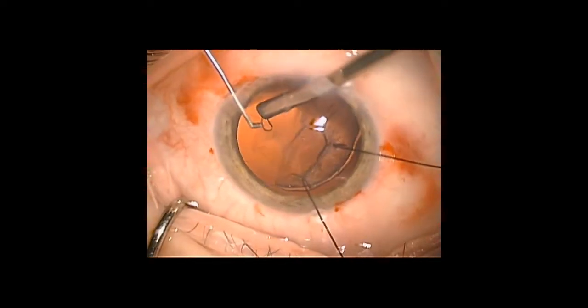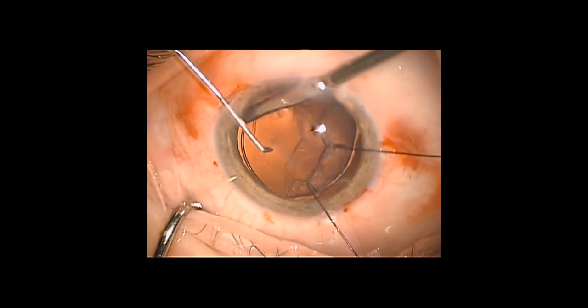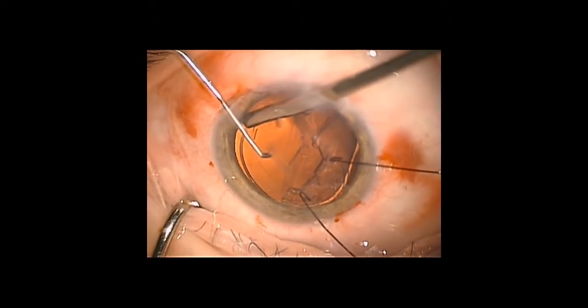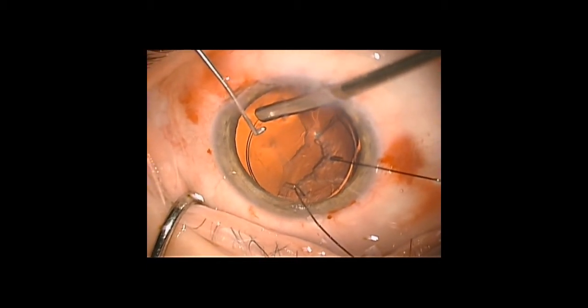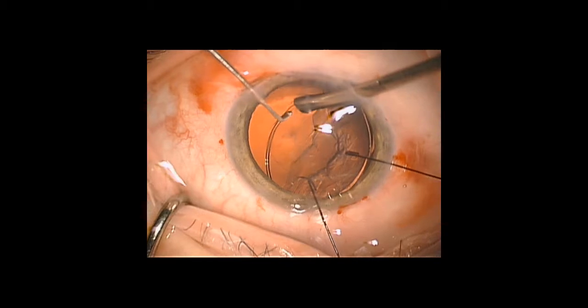As always, the capsular tension ring should be implanted extremely gently. The second instrument should always be at hand to facilitate and help remove and unclip the capsular tension ring from its introducer and ensure that the ring does not catch the anterior capsular edge but rather safely goes below this.